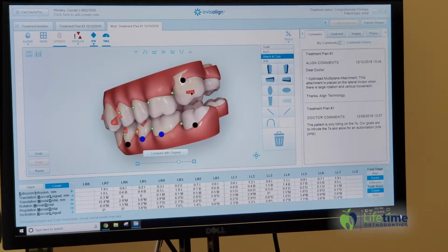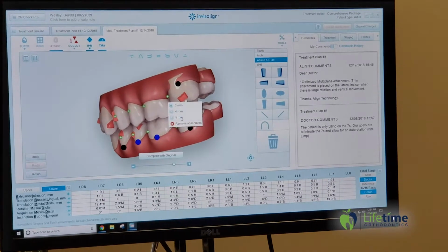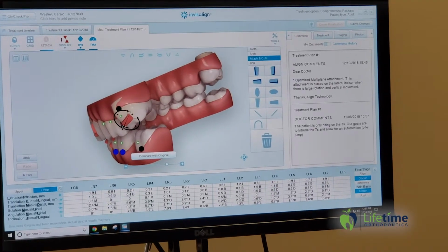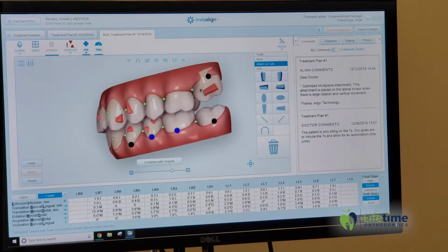Okay, and I'm going to make this larger. We want a 5 millimeter. And then I'm going to make this attachment as large as possible too. Okay. So there we go. So that's going to help to intrude that.